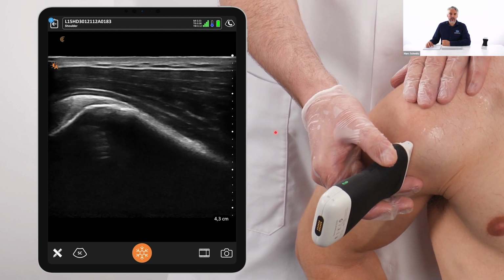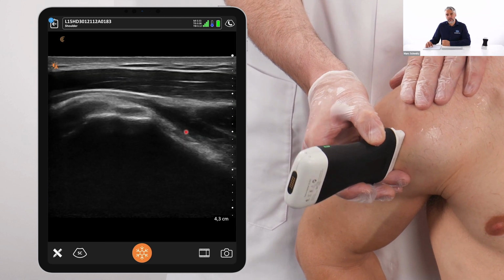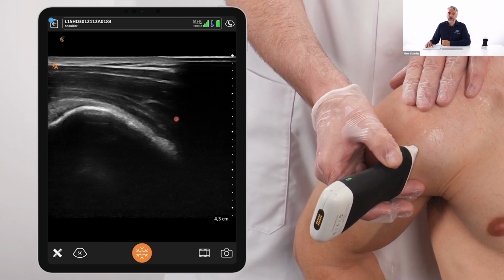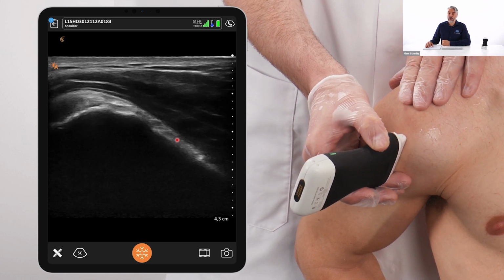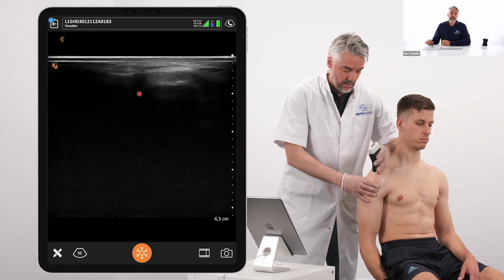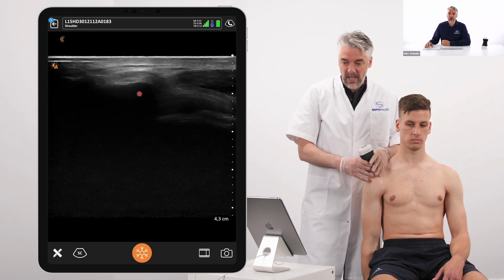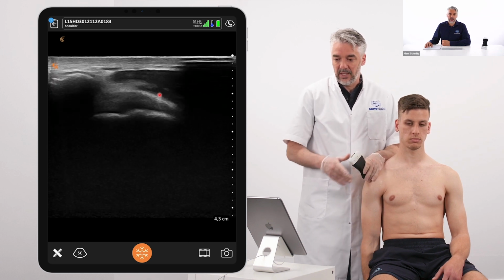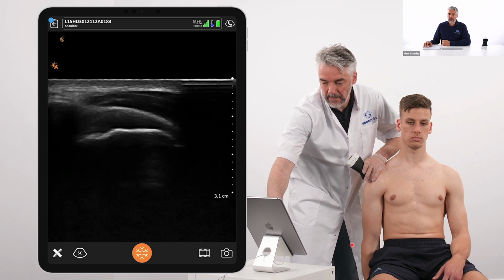You also want to be on the lateral edge of the greater tubercle in order to see bursal fluid or effusion right there, called a teardrop sign. Many people also forget to check that, because the bursa could look perfectly normal, but sometimes the effusion drops to the lateral side of the greater tubercle. Arm is neutrally next to the trunk.